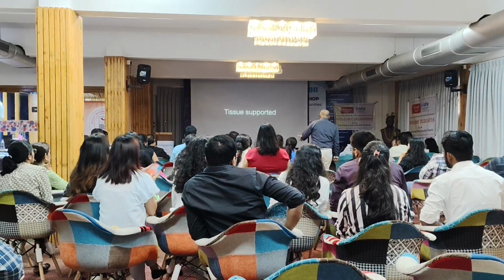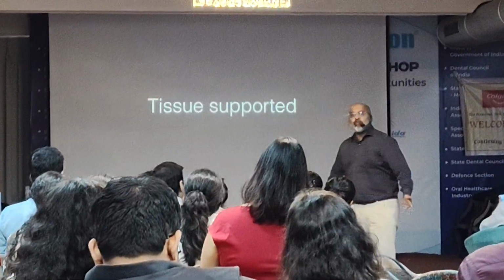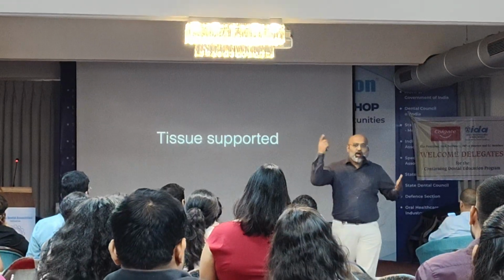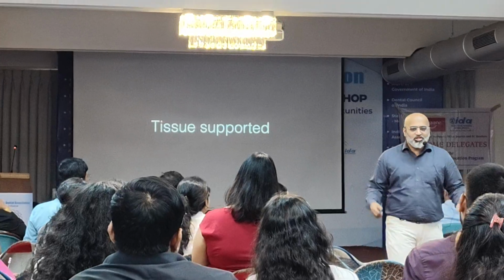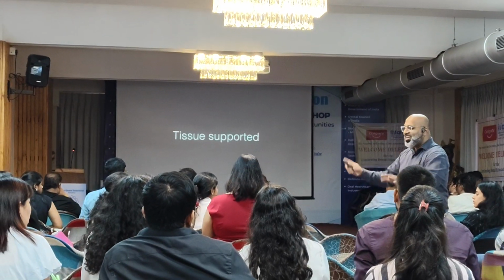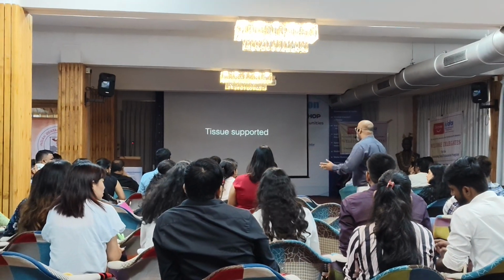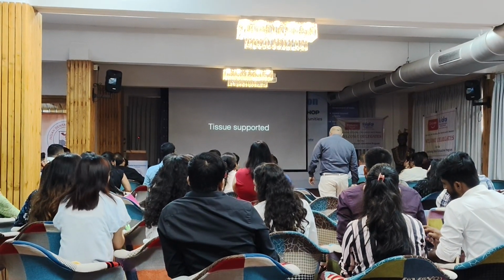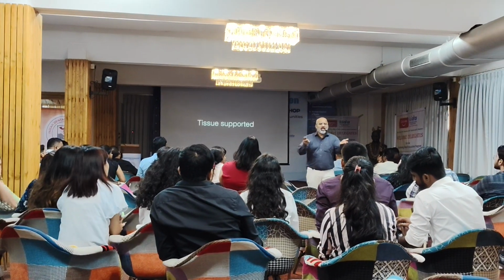So what are tissue supported guides? So the patient walks into your clinic and the patient wants maybe upper 6 and lower 6 implants, and that's like, okay, that calls for a good shopping experience somewhere down the line. It's like a shopping sale and I have got like 12 implant kits, right? So you just send the patient to the CBCT center for a CBCT, and the patient comes back and then you see, oh, I can only see the bone.